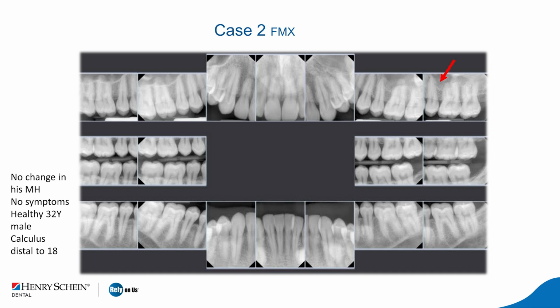And in the apical area of teeth number 4 and 5, you can also see that white, crisp, corticated structure there, which is more the floor and the medial wall. But it's impossible to see those structures on the left aspect of the patient. That should be there in the apical area of teeth number 12 and 13, which it is not. So again, it means trouble. Why is the floor not well defined there?